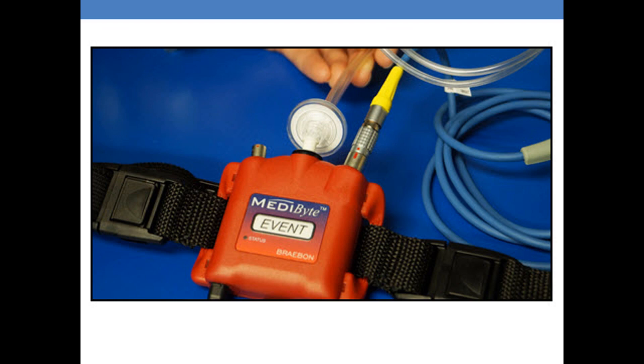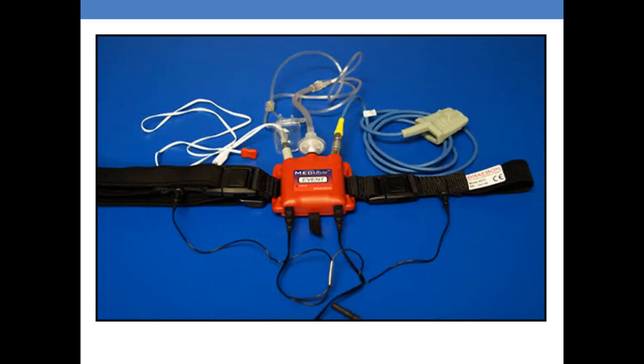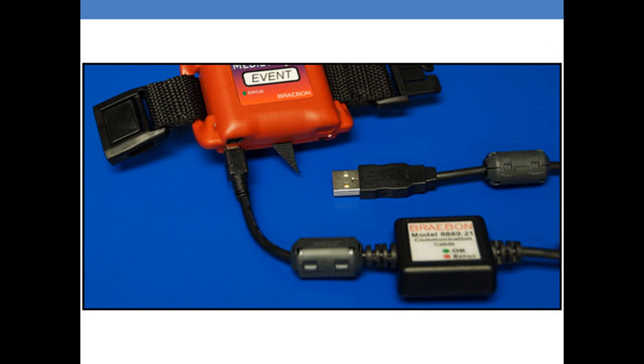Lastly, you want to make sure that you securely tighten the oral nasal cannula along with the filter. In this picture you will see all of the components connected for a snore microphone study. The only component left is the communication cable, which is the cable that you will use to upload and download your studies.